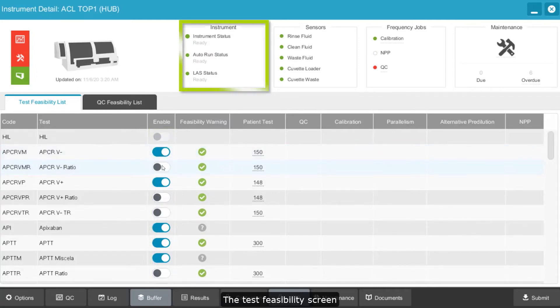The test feasibility screen displays key instrument and status sensors at the top, providing cues for the operator and allowing for increased walk-away time, enabling staff to focus on value-added activities.